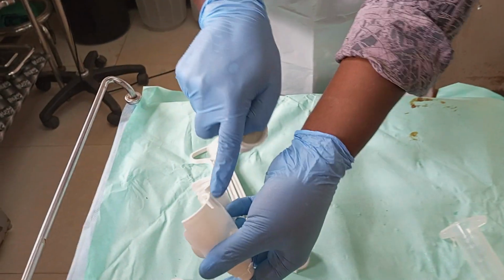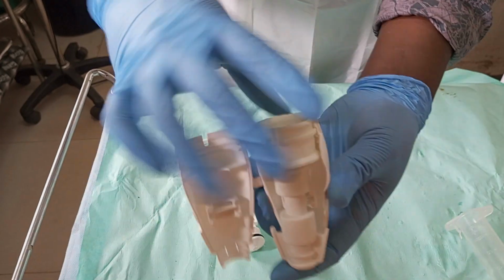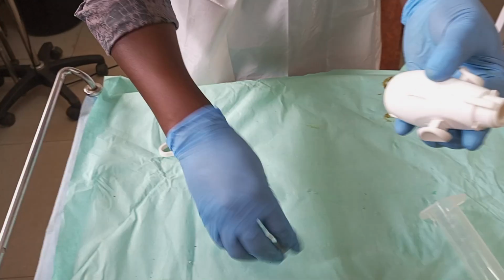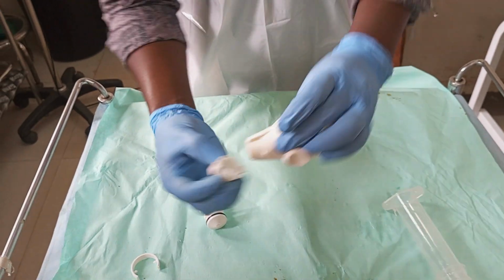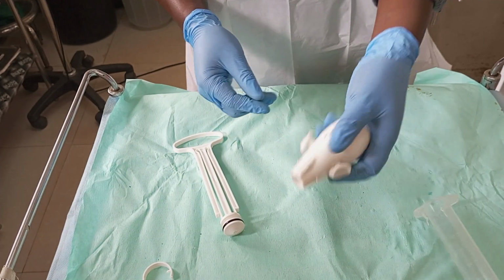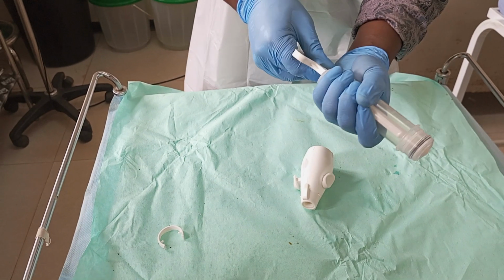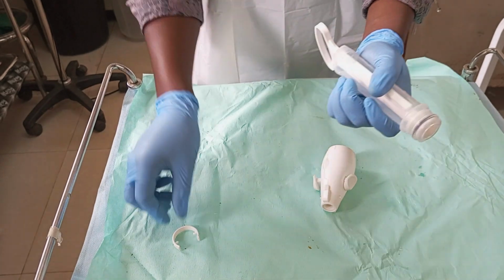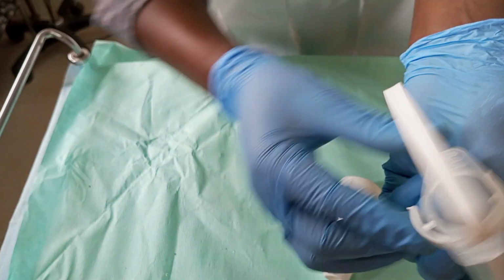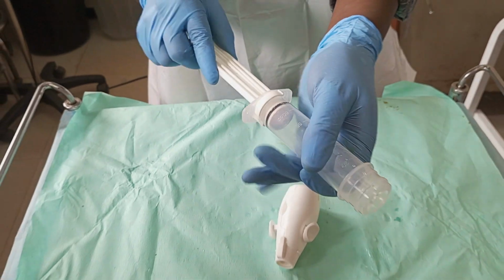Assembly is very simple. Valve liner, target this area. Okay, there it is. Then simply flip this one over and we are good to go. Then a cap, see the correspondence, fit it like that. Next, the plunger into the cylinder, making sure of alignment, stopper here like that, just fitted, preventing the plunger from coming out of the cylinder.